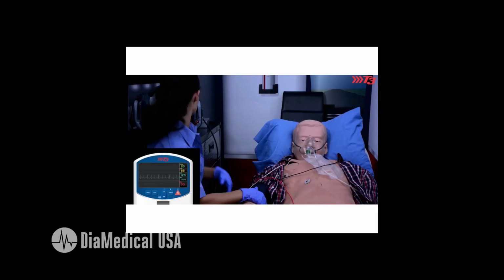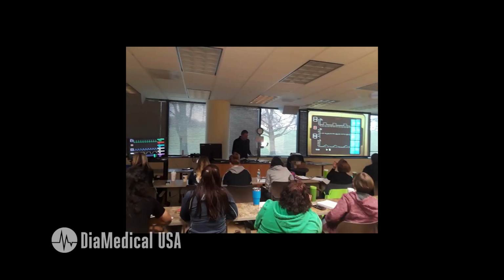SimVS can be used in many settings. As we mentioned, you can use it with lower fidelity mannequins that you turn into higher fidelity mannequins. The lower fidelity mannequins may lack a monitor function, so now they can have a monitor function. It's also very good to be used with standardized patients, and also it's a great classroom learning tool when the screens are projected, allowing discussion of the physiology as it's flowed through.